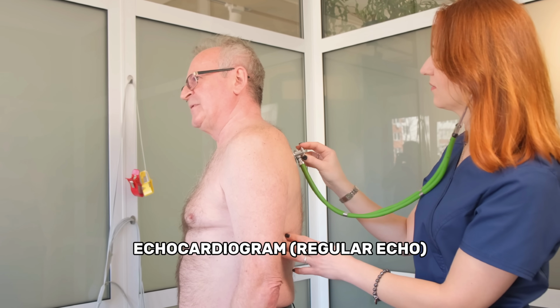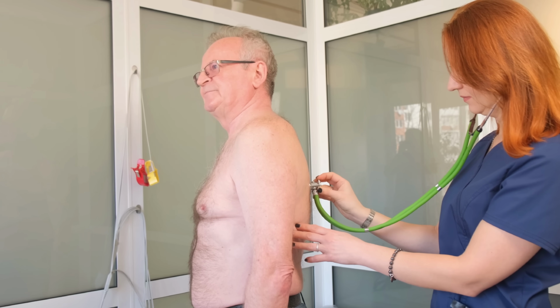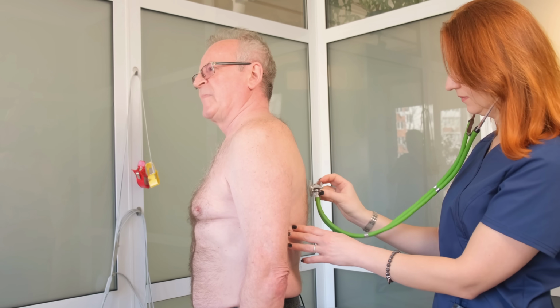Regular echo. Regular echo, apart from stress, is something that we do all the time. It's the mainstay for us. Well, I can use this really old technology. Yes, this is all beyond history and physical exam. Obviously, history, physical exam, and a good physician with a stethoscope can pick up a lot of clues as to what might be going on, particularly as it relates to valvular heart disease. But echo is fantastic for that.